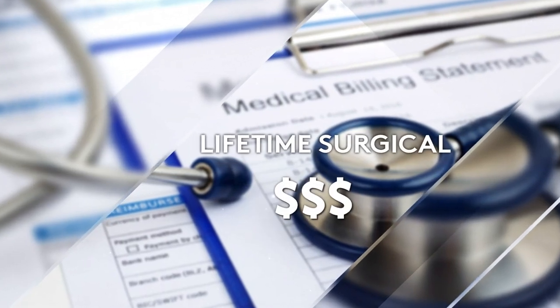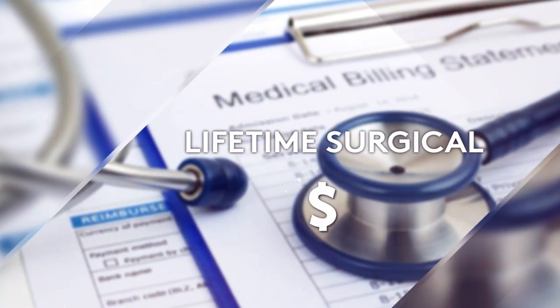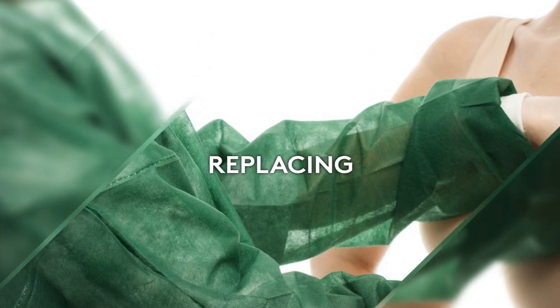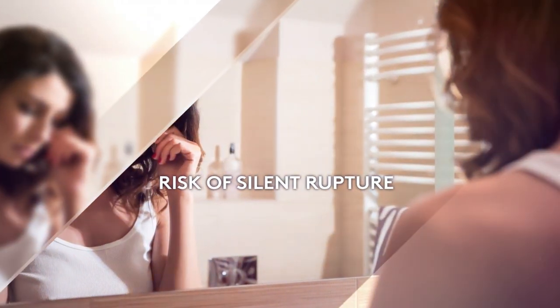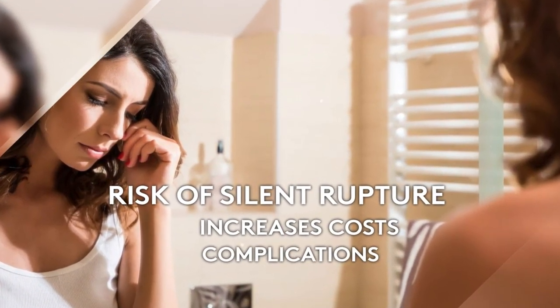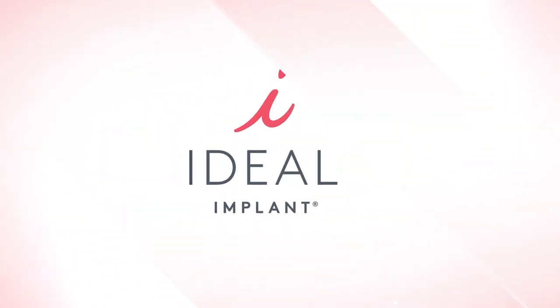The lifetime surgical cost of the ideal implant is often lower than silicone gel, as you can keep your ideal implants in place as long as they last. Many surgeons recommend replacing silicone gel implants every 10 years due to the risk of silent rupture, which increases potential costs of surgeries and complications not covered by insurance or product warranties.